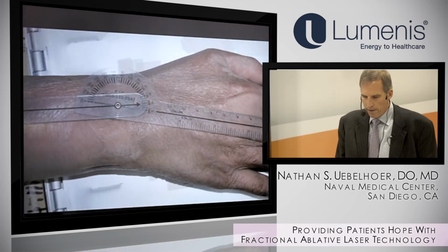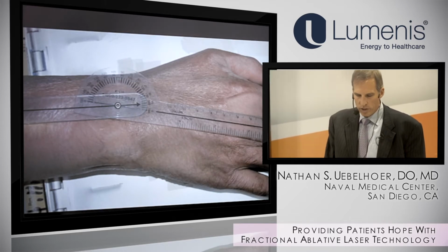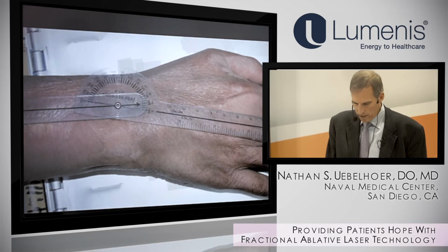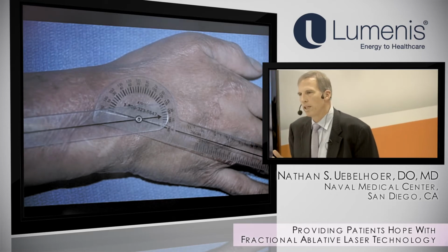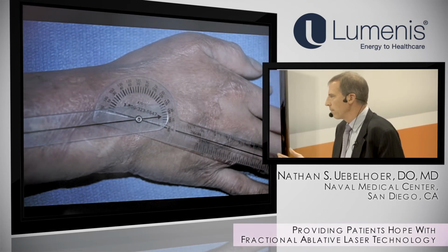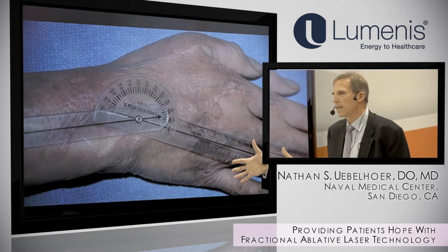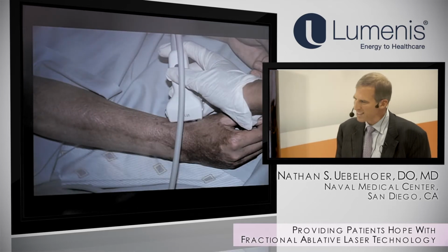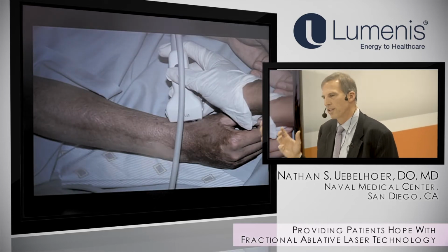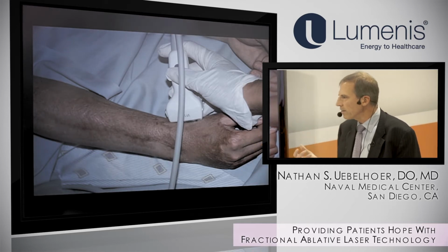It's very exciting. Here's another burn scar on one of our wounded warriors, and you can see there's very little change from the pre-treatment to the post-treatment. His range of motion only increased about 13 degrees, but that amount of improvement reduces pain and also increases the quality of life, and that's what's been so exciting. This gentle, small improvement with very conservative settings, a very low risk treatment, can get you significant improvement in quality of life.